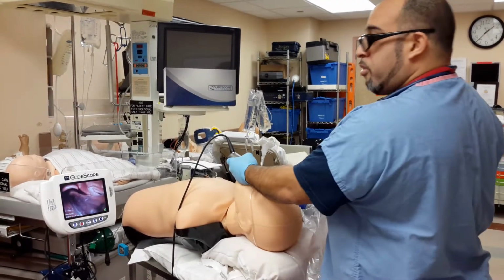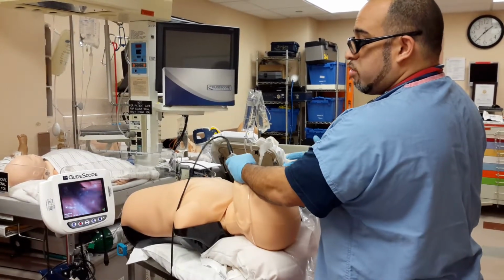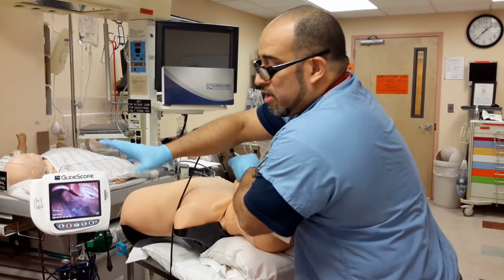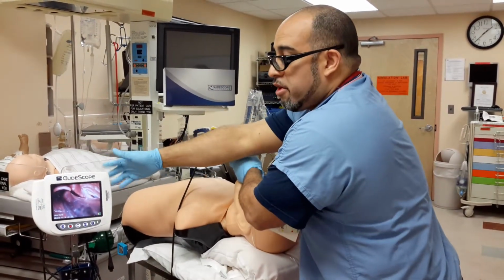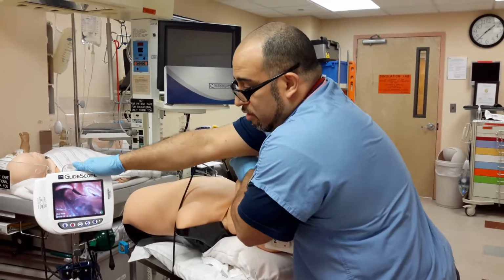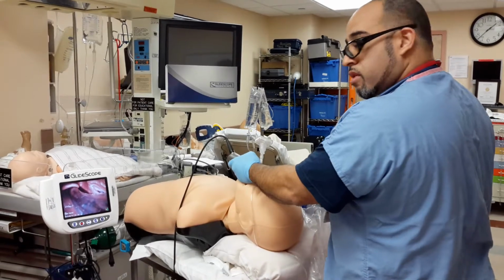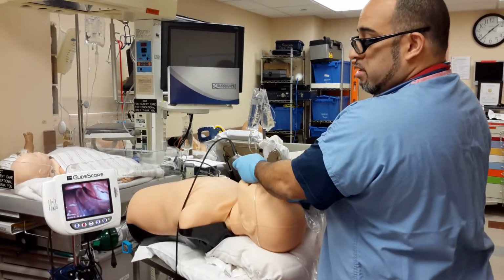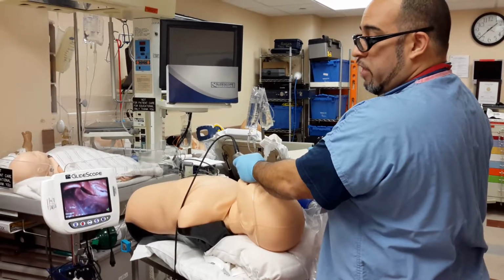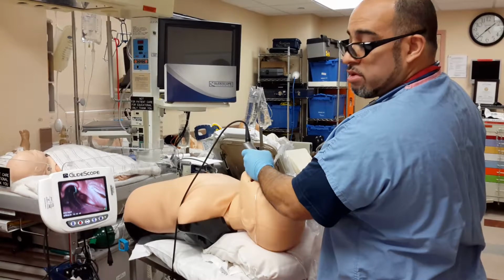And then when people have problems and the patient is too anterior, you should then theoretically use it like a Mac blade with a video camera, monitor for everyone else to see what's going on. And if there's difficulties, eventually turn it toward the person who's intubating or the more advanced intubator who takes over. And if this patient had a horrible POGO, percentage of glottic opening of 25% or 0, let the more advanced person expose the cords.